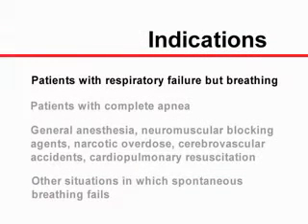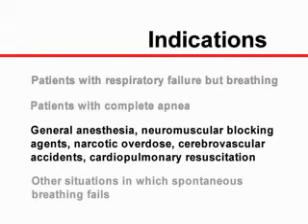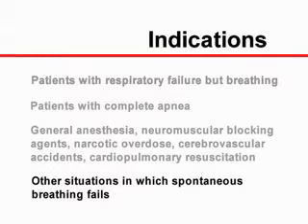Face mask ventilation is used in patients with respiratory failure who are still spontaneously breathing, and in patients with complete apnea. Face mask ventilation can be indicated after the induction of general anesthesia, the administration of neuromuscular blocking agents, narcotic overdose, cerebrovascular accidents, cardiopulmonary resuscitation, and other situations in which spontaneous breathing is failing or completely ceases.